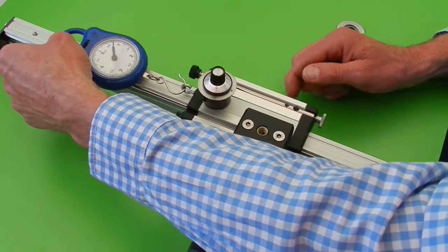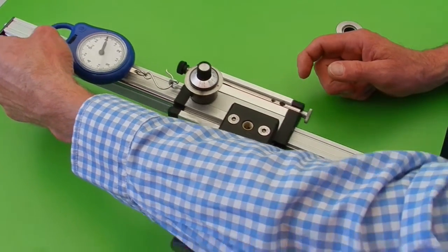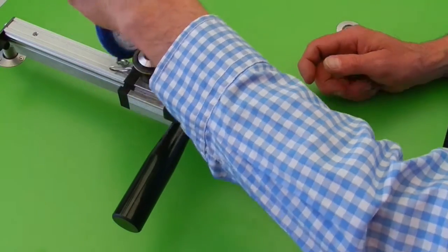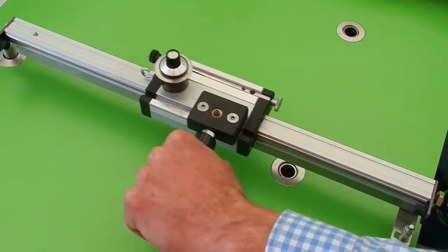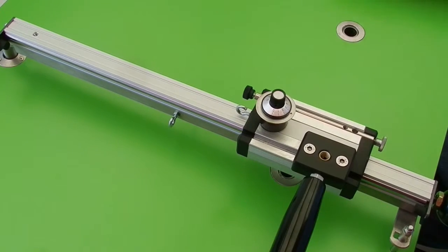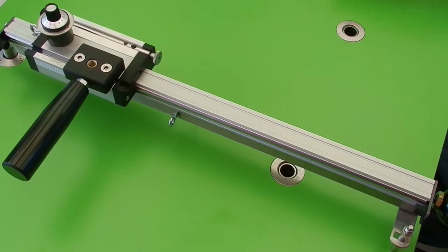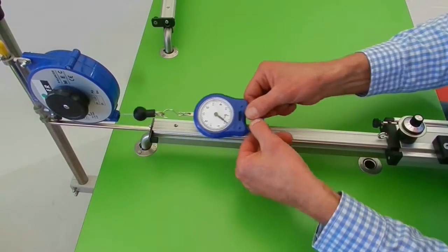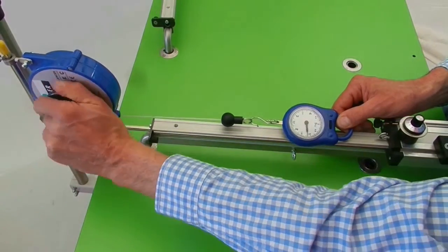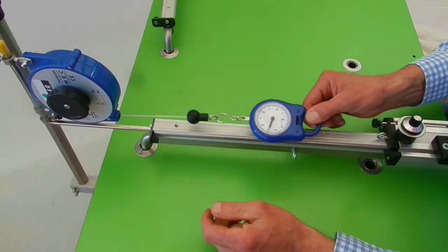The resistance of the sledges, which should be overcome in the movement, changes due to the screw on the sledges. The switchable balancer, which is adjustable to 3 kg, enlarges the movement space during the training of the arms.